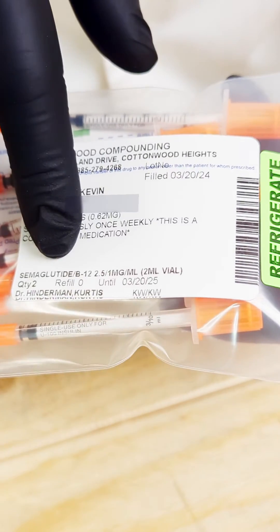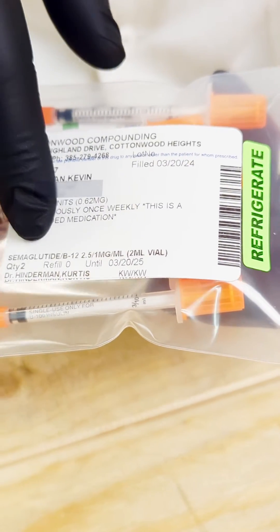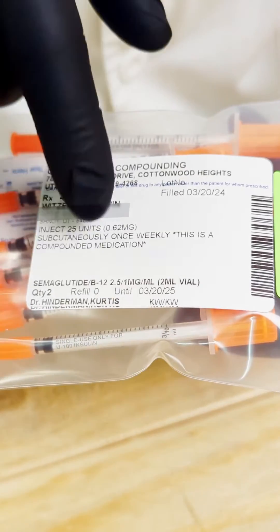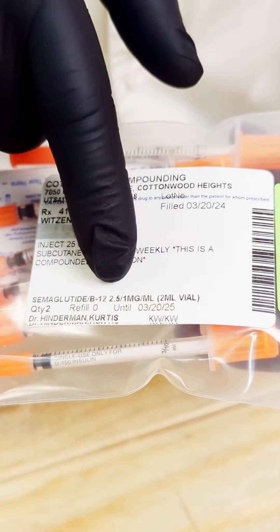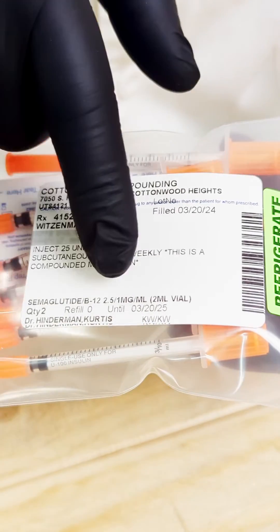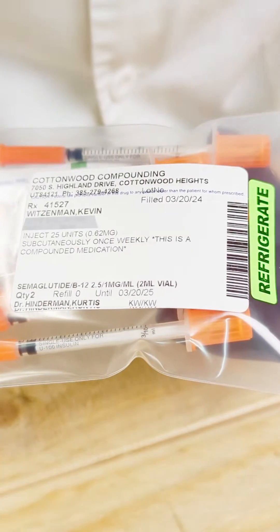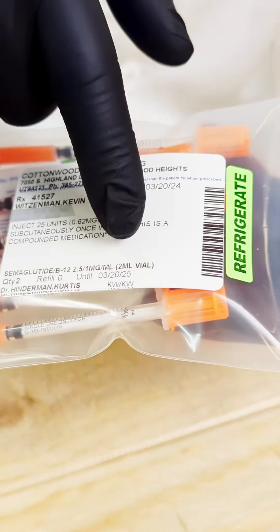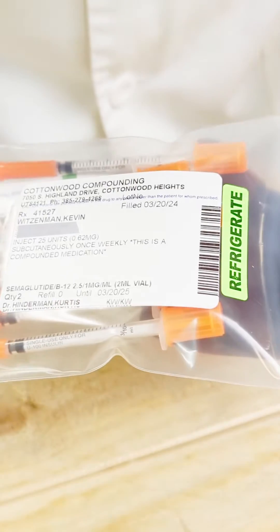You'll have the medication itself, it has to be listed out in active ingredients. So, semaglutide, B12, and then the numbers at the end of it, 2.5 relates back to the semaglutide, 1 milligram relates back to the B12 and that's per ml. And then this medication itself is a 2 ml vial.